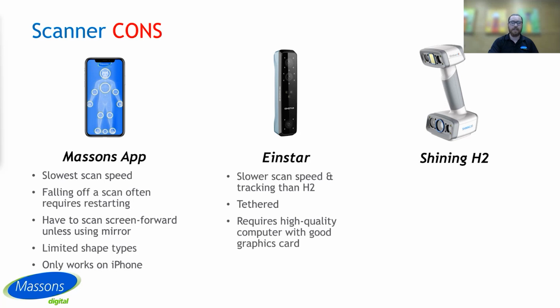This does mean it also requires a high-quality computer with a good graphics card to function, but you will find this as a feature on almost any high-end scanner that isn't a fully standalone unit. It's also not considered viable for cranial scans, so if you are looking to take those scans, we'll need to move up the line towards white light, but it can be useful for almost any body type otherwise.